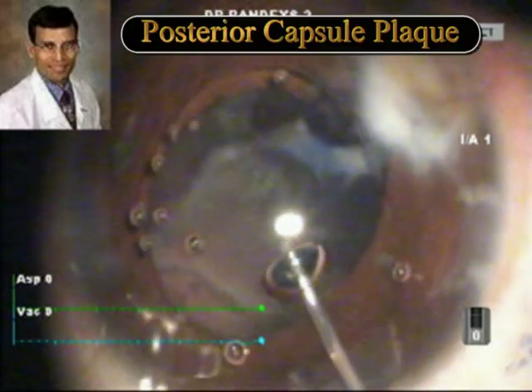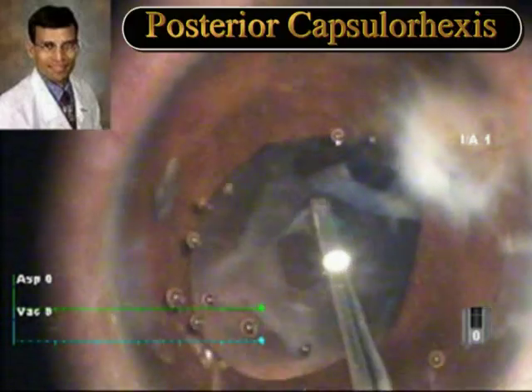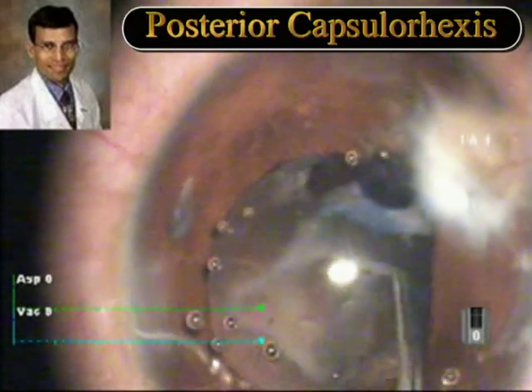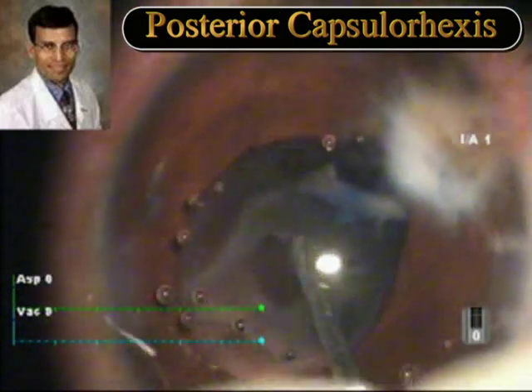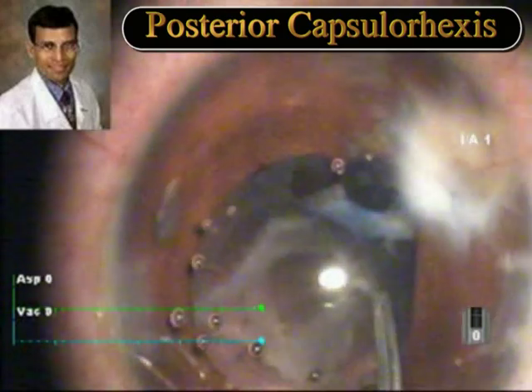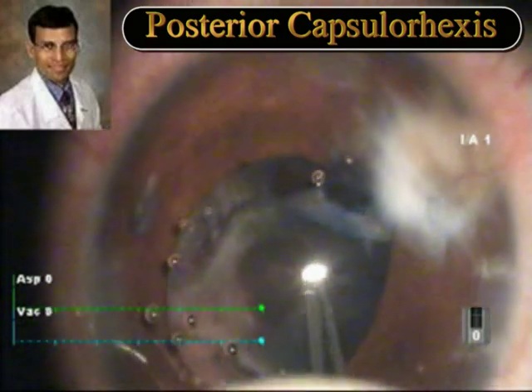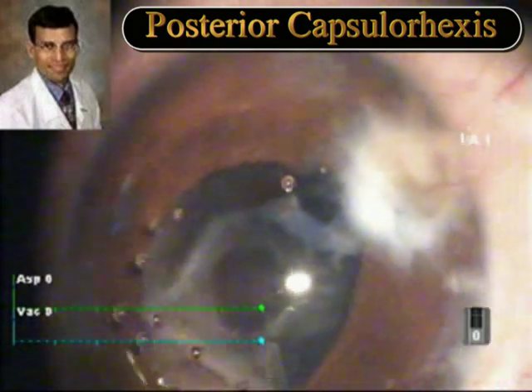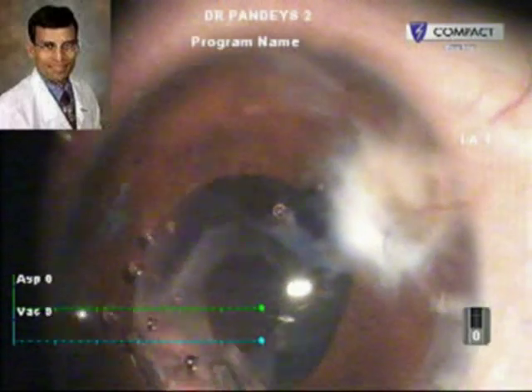At the end of the cataract removal, a posterior capsule plaque was seen and a posterior capsular rhexis was performed. Viscoat was used to tamponade the vitreous so that there would be no anterior movement of the vitreous during the posterior capsular rhexis. Once the vitreous was tamponaded, the posterior capsular rhexis was attempted. But during this process, the entire posterior plaque came out on its own while the posterior capsular rhexis was being formed.